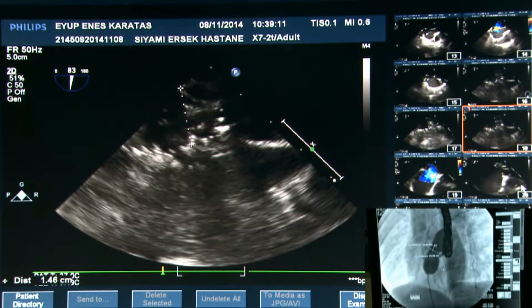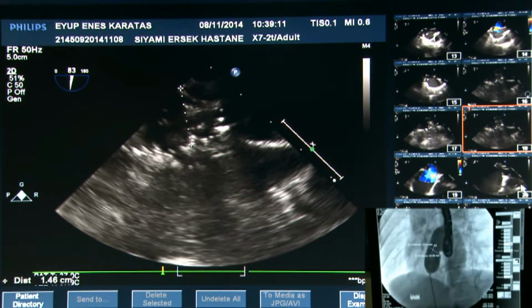In this, fairly firm rims, whereas if you have floppy, then yes. In floppy, you add 4, or in firm rims, you add 2? So what I do in floppy rims is there's usually a rigid part and then a floppy part, and I use the measurement of the rigid part to the rigid part and base the device selection on that. And that tends to be between 2 and 4 millimeters more than the 2D defect. But you do balloon sizing with floppy rims anyway.